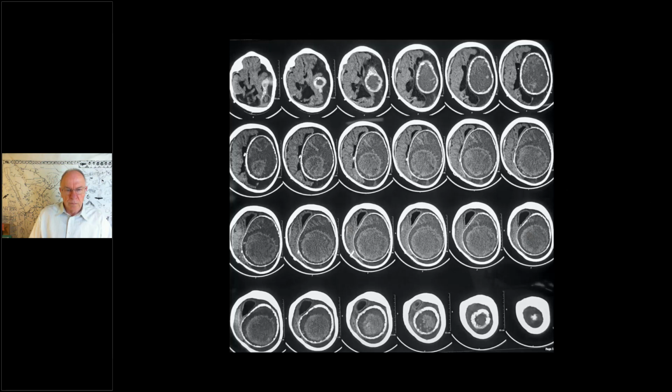CT was done, and on CT you can appreciate that there is a well-walled-off lesion in the extra-axial space on the left side. Subdural hematoma on the right. No internal calcification or hemorrhage within this lesion. So we have a diagnosis, but at this point, probably I have to open this case for any further comments. If anyone has seen such a presentation of a long-standing hydrocephalus on VP shunt.